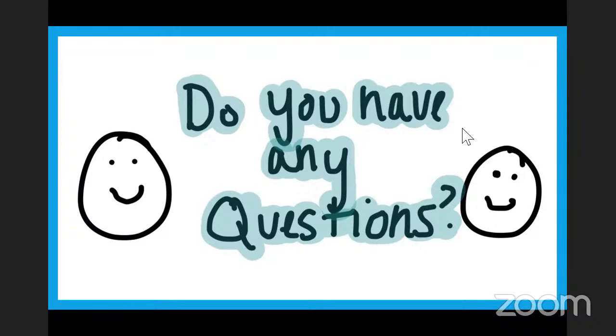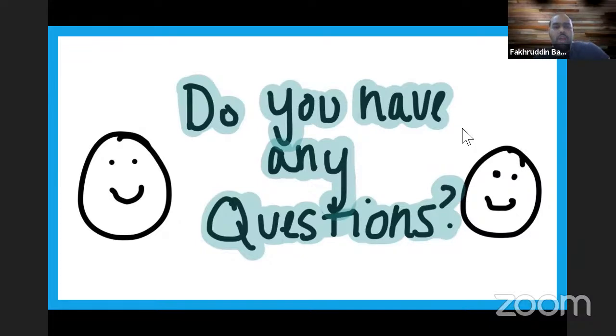So we have a question from Miss Ankita, who wants to know whether there will be any effect on a contact lens patient if they are under any medication, and can they continue wearing contact lenses or not? They can definitely continue wearing contact lenses, of course. Now, what kind of medications are you talking about? If there are any topical eye drops which they need to put onto their eye, for example, if they are under any glaucoma medication, we would recommend the patient to put in the drops first. Once the effect of the drop has gone, about 10 to 15 minutes is a good and safe time, and then put on the lenses. So that's the topical part of it. If they are taking any systemic drugs, for example tablets for diabetes, I think the drugs directly won't affect the lens wearing, but you must make sure that the patient is free from any ocular effects of that particular systemic disease. So doing an ocular health examination would be ideal before you choose the lens for the patient. So I hope that answers her question.